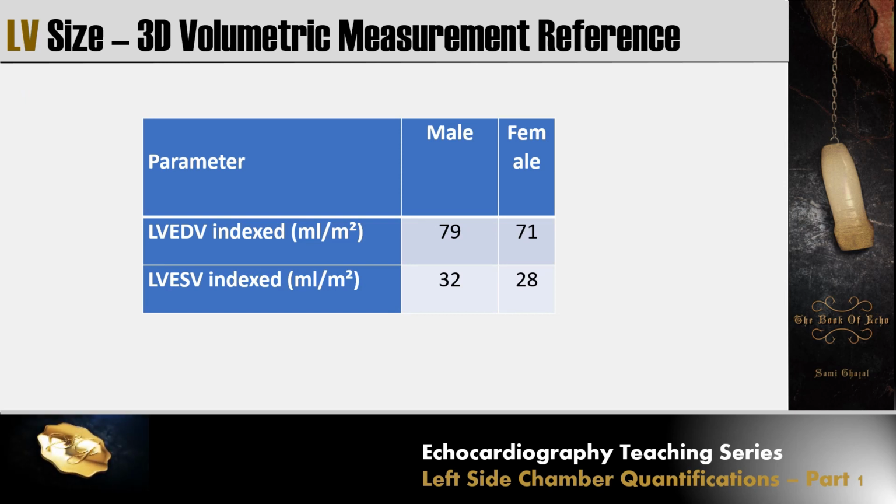3D volume measurements have a reference range. However, it is not as well established as the volume we get from 2D.